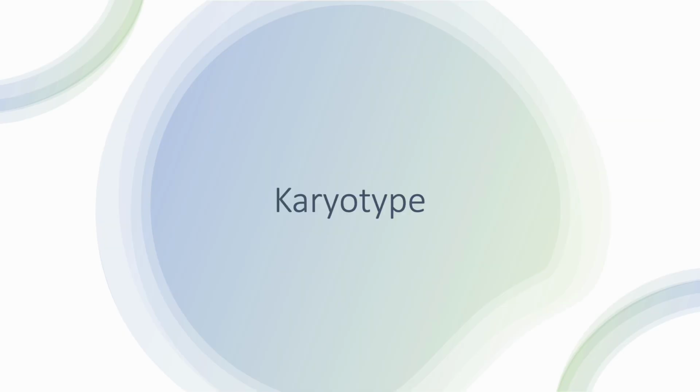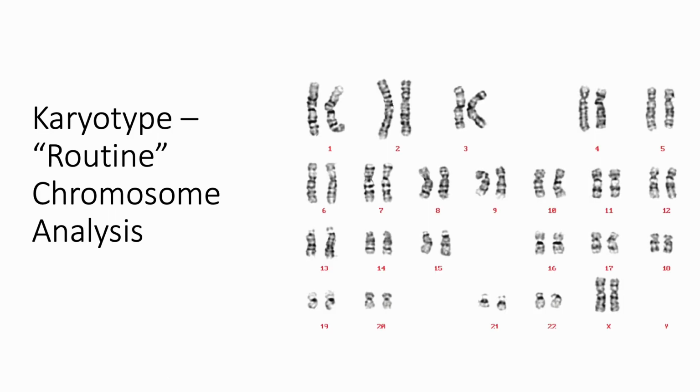Now that we are more familiar with chromosomes, let's take a deeper dive into the karyotype. This is an image of a euploid female karyotype, which shows a complete set of chromosomes from a female cell. Euploid refers to a cell that has the expected number of chromosomes for a species. In humans, this means 46 chromosomes: 22 pairs of autosomes and 2 sex chromosomes, XX in this case. You'll notice each chromosome has distinct dark and light bands. Again, these banding patterns help identify specific regions on the chromosomes.